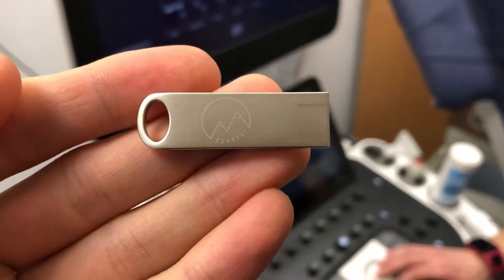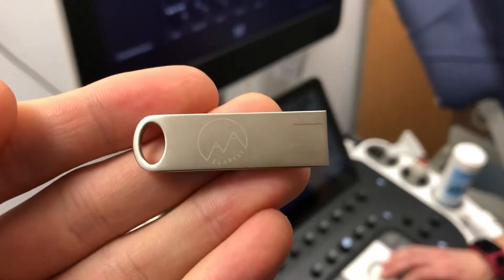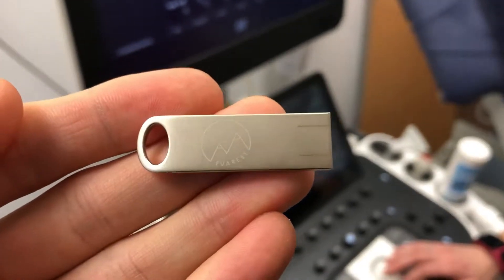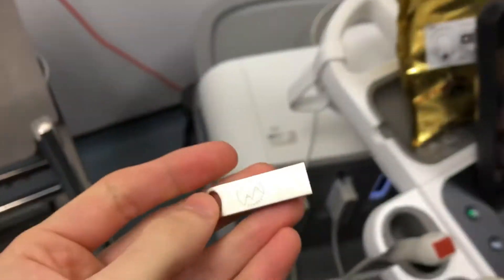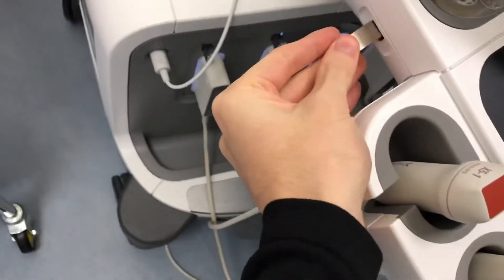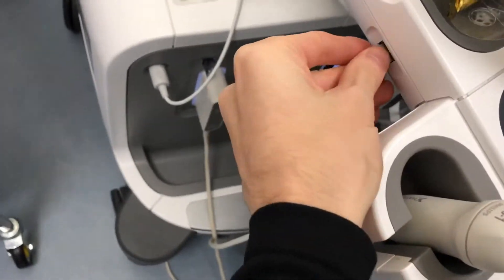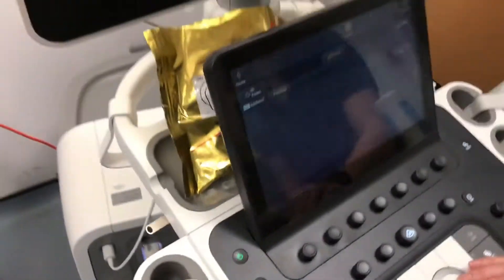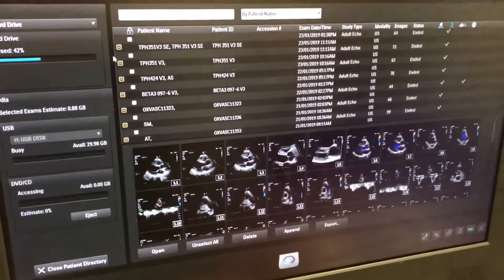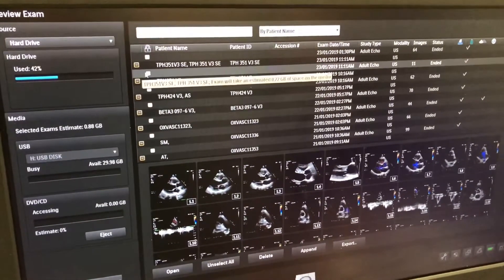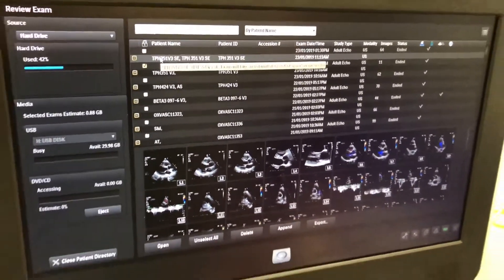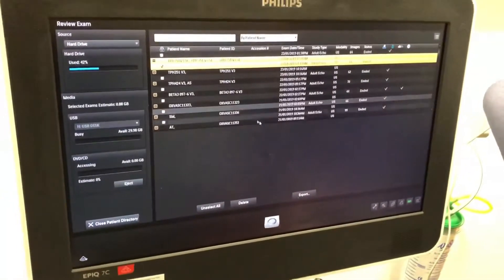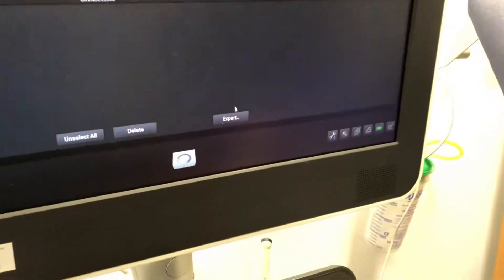The first thing to do is to insert a USB stick or hard drive — it has to be completely empty — into your machine. Then select the study that you want to export and scroll down to the export section.